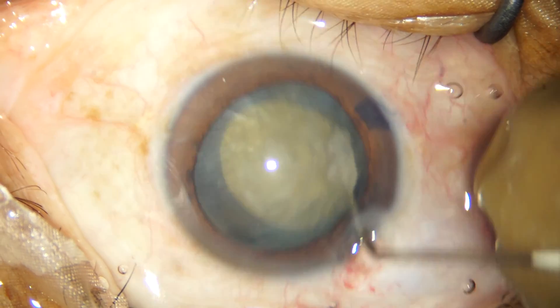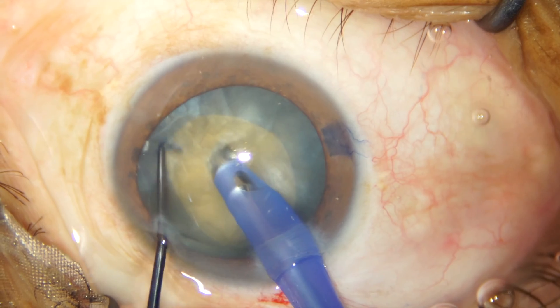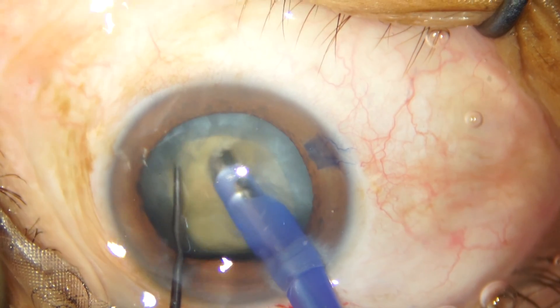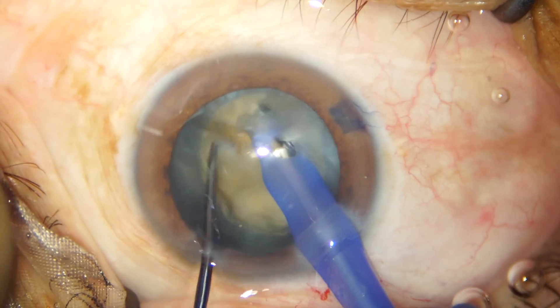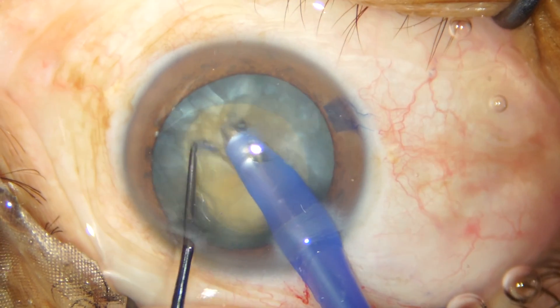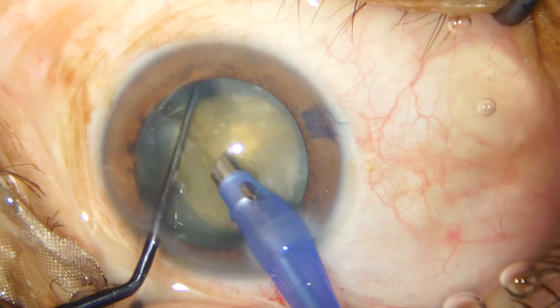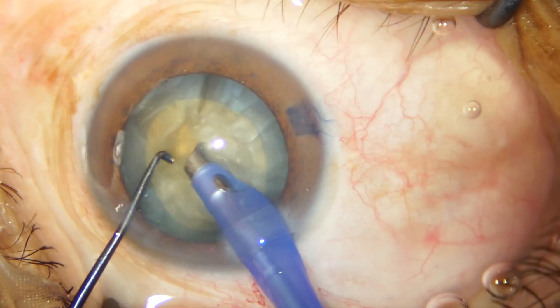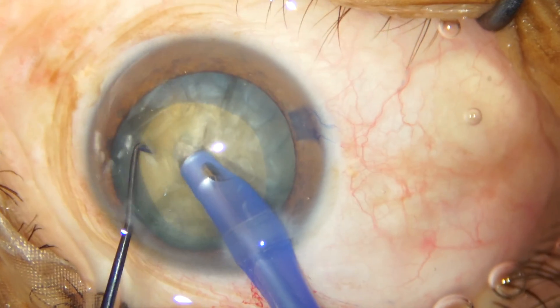The nucleus is rotated easily and we go ahead with a direct chop. I am using the Oertli cataracts one machine, which is a super machine from Switzerland. It's a pretty good machine for almost all grades of cataract and as you just saw, I got my first chop, rotated the nucleus, and I am attempting the second chop.